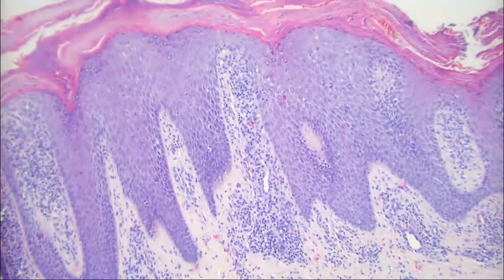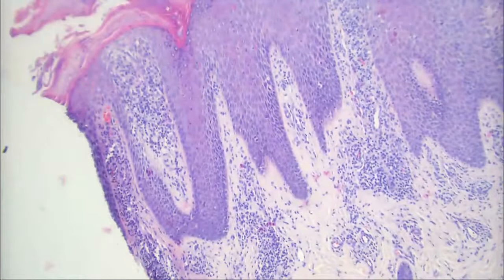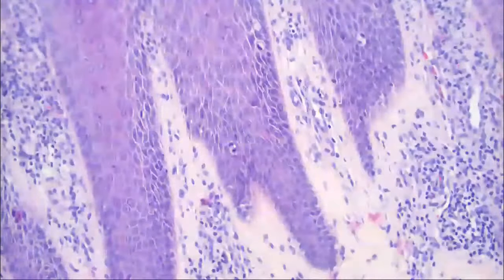So what's the diagnosis? Psoriasis. Psoriasis. Excellent. Good. So this is classic psoriasis. If you guys didn't get this, Dr. Mincher would have a stroke. So you better make sure you know what psoriasis is. This is a classic, beautiful example of psoriasis.